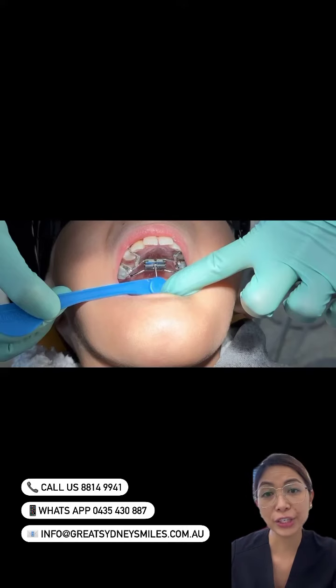It is important that you follow the instructions given to you on how many times to turn the expander. Generally we ask you to turn it once a day for 28 days, but the orthodontist will confirm this with you. If you accidentally miss a turn, don't worry too much as you can make it up another day. We do give you a calendar so that you can write a log on how many turns you've done and on what day.